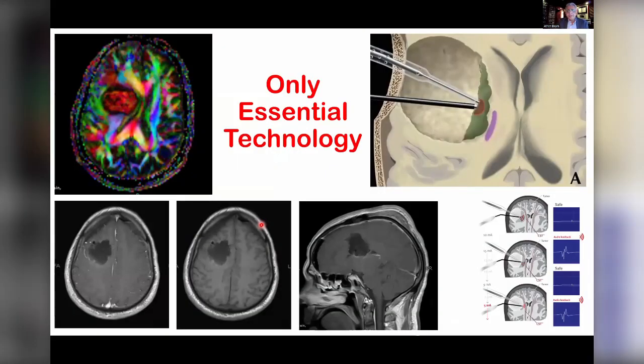And I think we should only focus on essential technology. So for example, here's a patient with a GBM that I did surgery on. It shows very clearly that it is right next to the posterior limb of the internal capsule, right next to the genu. And although I did have this image and could have used it to guide me through surgery, that's a more expensive way.